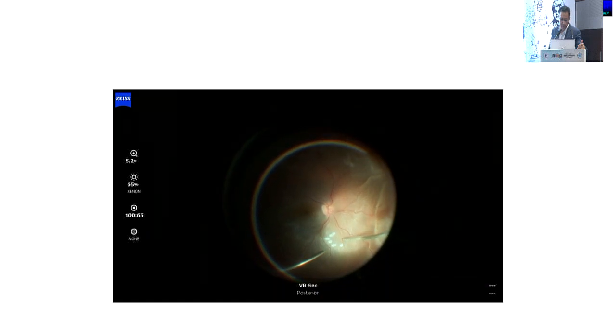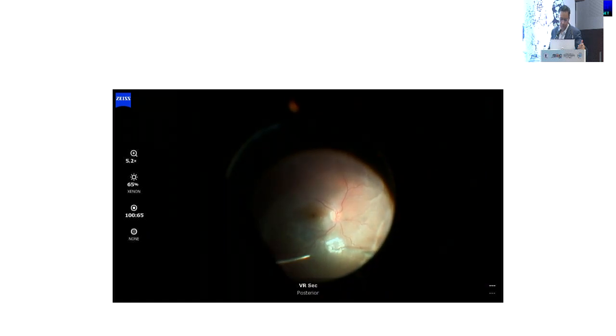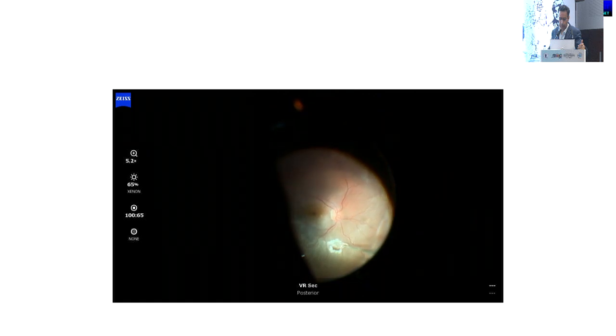This was the area where we are going to take the graft. I prefer to use scissors rather than the cutter because the scissors are more controlled.